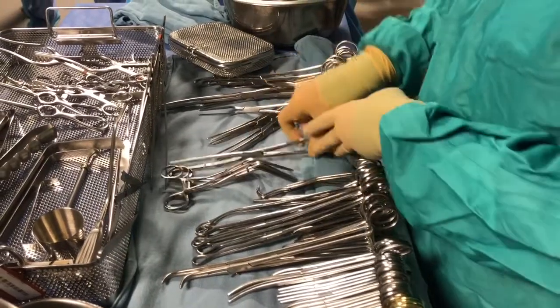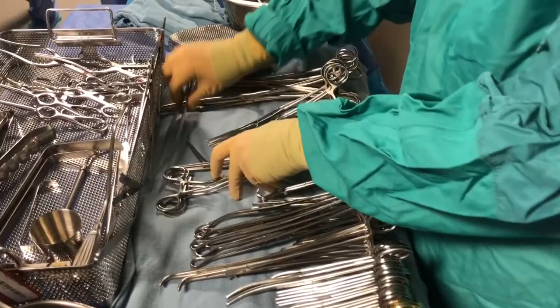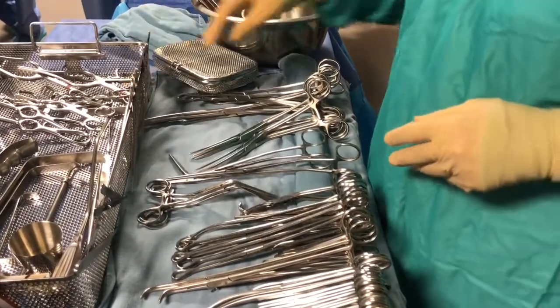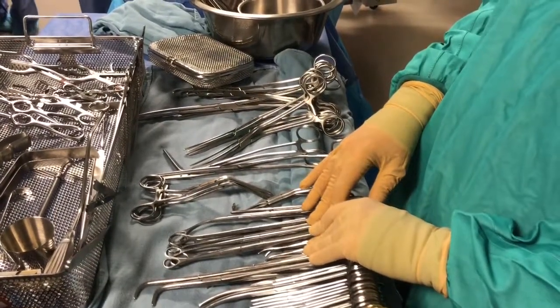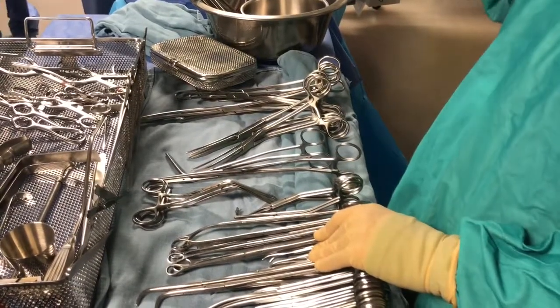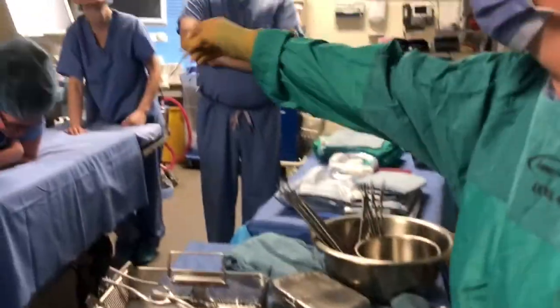What's that? You ingrained that everything was supposed to be open in our brains, and now you're telling us to close things. How are we supposed to know the difference? Open when we're putting stuff away, right? Open when I'm putting stuff away, because when you're handing them up, they're closed. When you're handing them up, or you'd be doing this to your doctor.